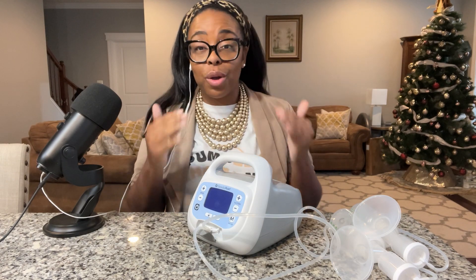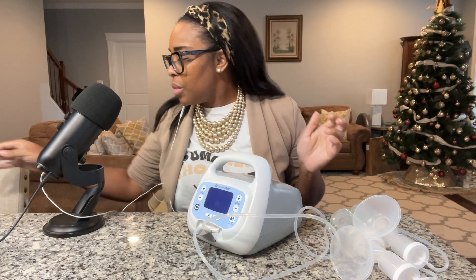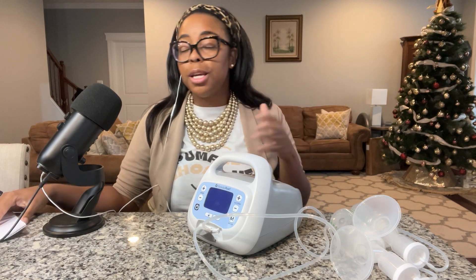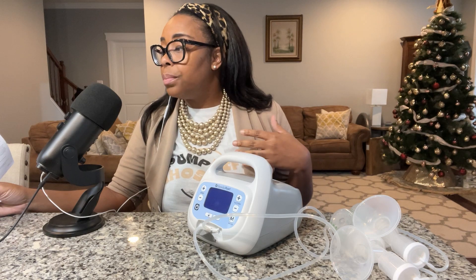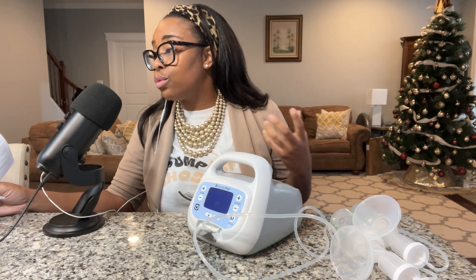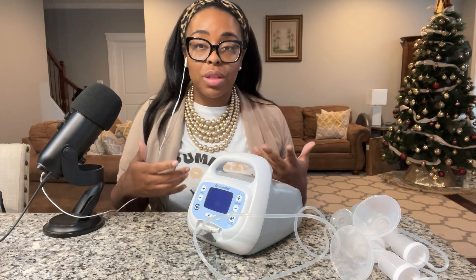I want to talk about how to operate the pump. It has about 78 settings total. I pulled out a couple of highlights from the manual: it has a stimulation mode and an expression mode. The stimulation mode speed ranges from 80 to 120 cycles per minute, and the expression mode ranges from 30 to 48. It also has at least three hours of battery life after a full charge, and automatic power shut-off after 60 minutes.